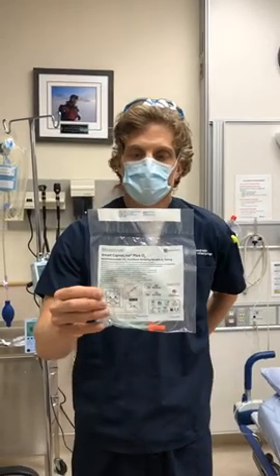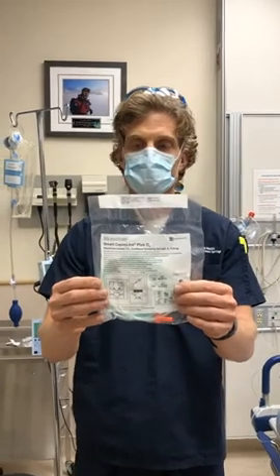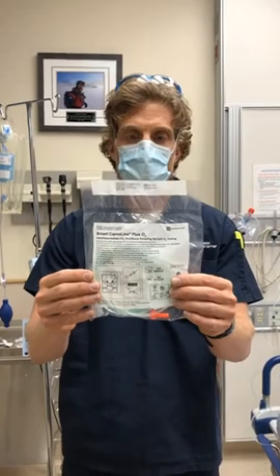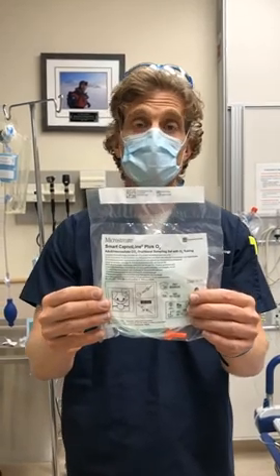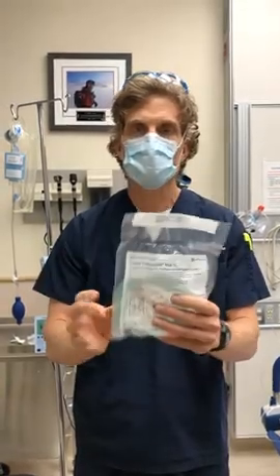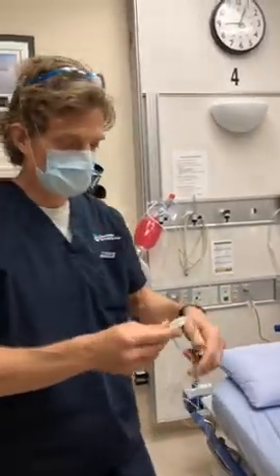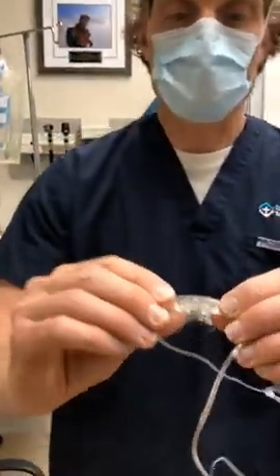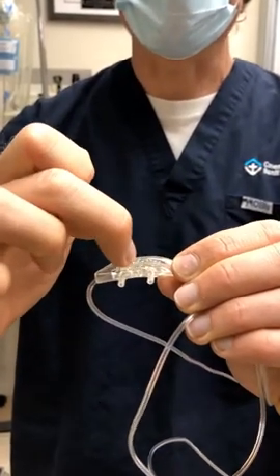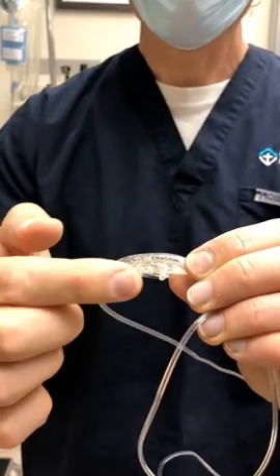Folks, you'll recognize this device — we just got this at all the bases. It allows for end-tidal CO2 monitoring in the non-intubated patient. It also allows for O2 insufflation, and there's a question that has come up around how much O2 flow we can get through this. The O2 actually comes through these tiny little perforations here, and the CO2 is sampled here and here.